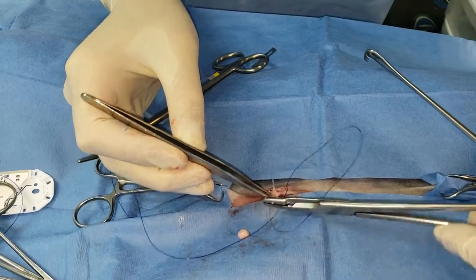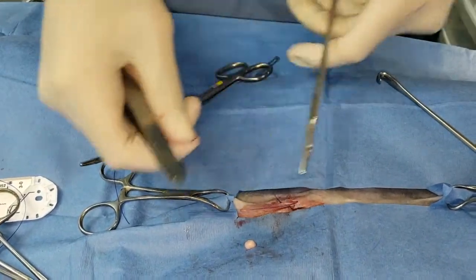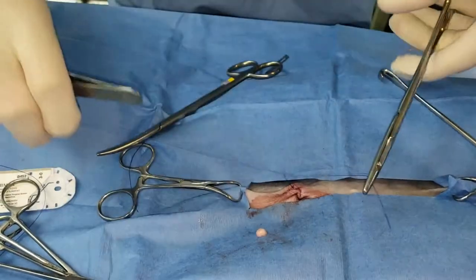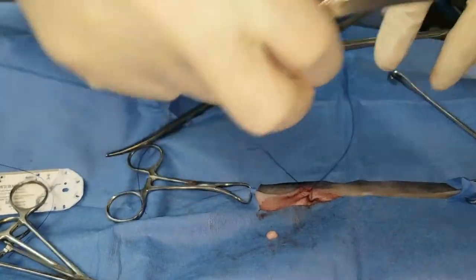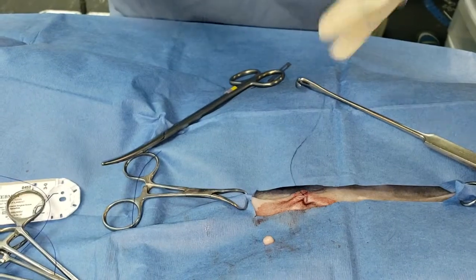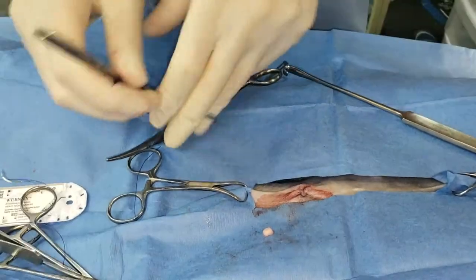Usually this inverts things and opposes the skin pretty well. Pull it, cut it, and then just like your regular buried knot you can flip it underneath. I actually try not to do this because it was frowned upon in my residency — you should just bury it properly — but I find this works pretty well. And that's it, we're done.